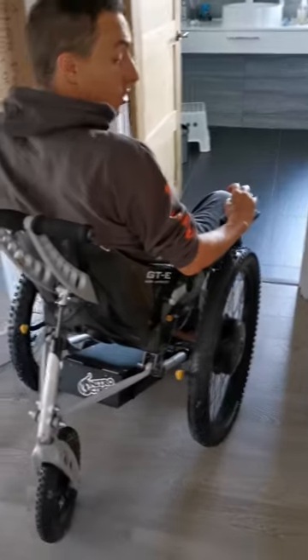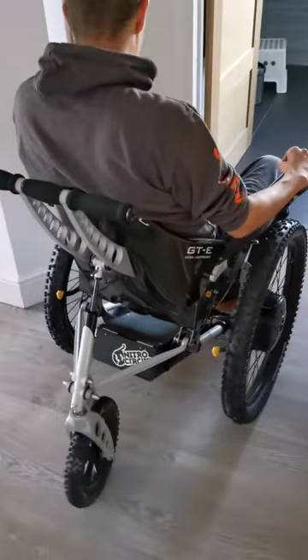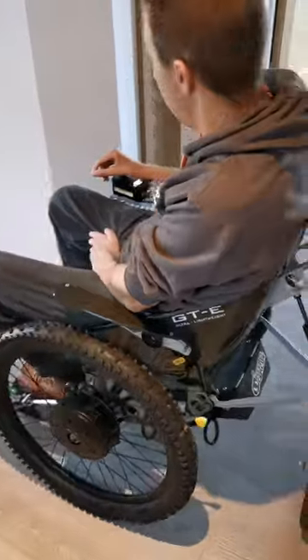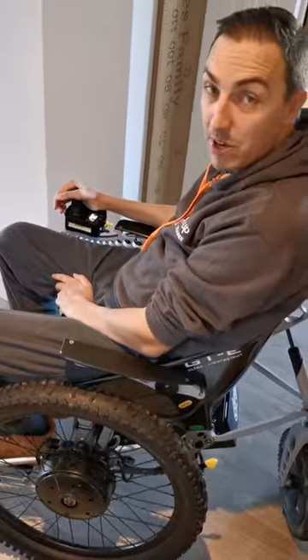Going backwards, just having a look over my shoulder. Turn around and we're facing the right way.